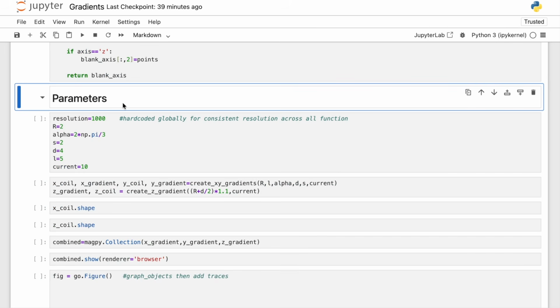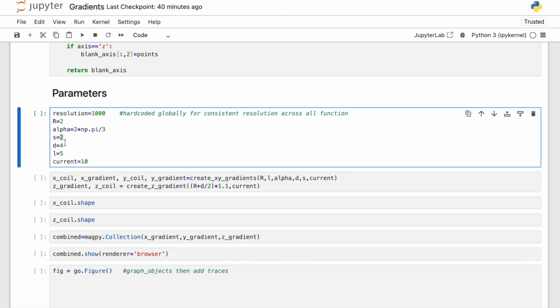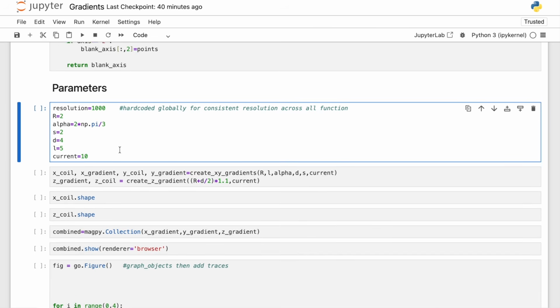So here we have our parameters. As we said, the resolution is hard-coded for all the functions. R is 2 meters. As we said in previous videos as well, Magpylib uses SI units. Alpha is in radians. Currently it's 2 pi over 3, which is 120 degrees. Separation is 2 meters, distance is 4 meters, the length is 5 meters, and the current is 10 amps.